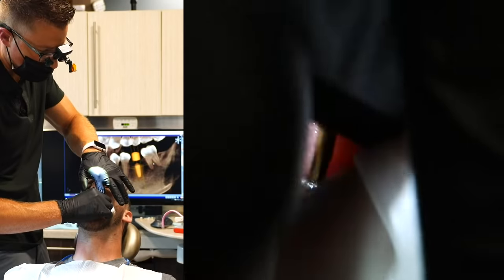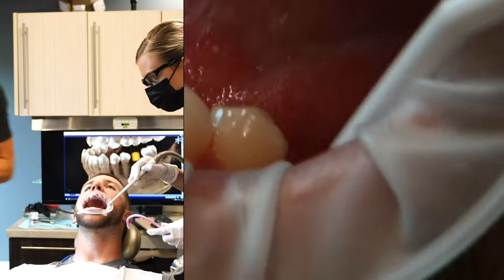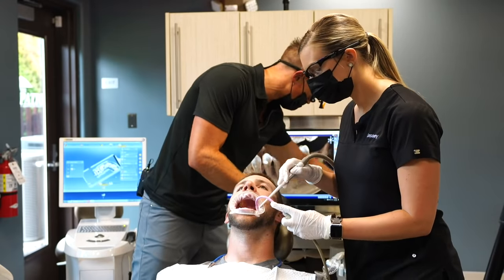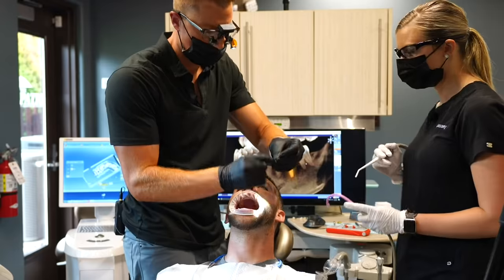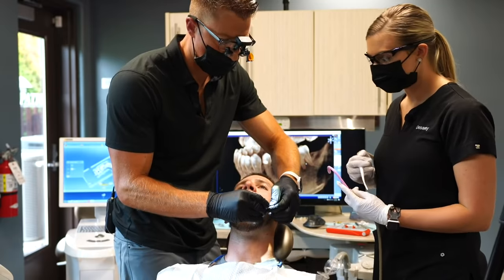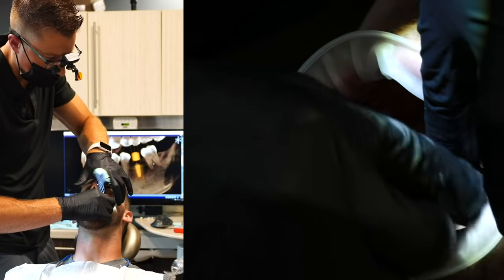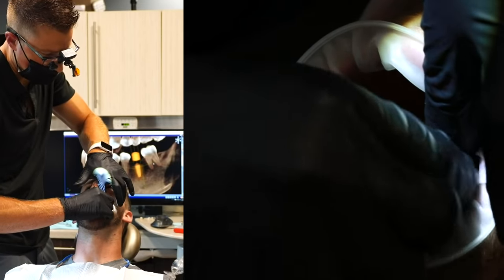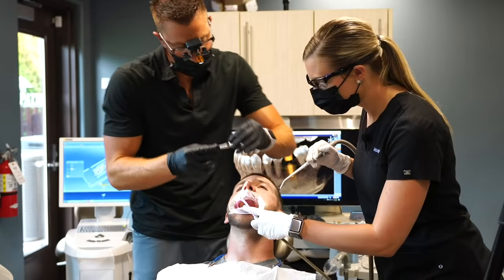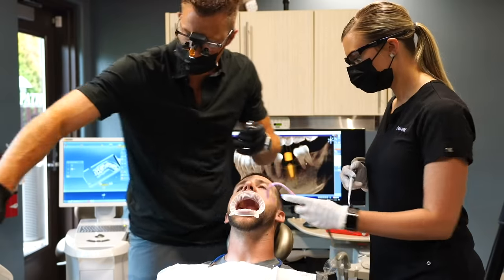And then the last little bit here is just putting a little healing cap. Let me show, I don't know if you're probably still zoomed in on the mouth there, Michael. I'll show viewers what a healing cap looks like. So that right there is our healing cap. And it is purple, color-coded with that same connection. And it will go right on top of that implant. And we'll tighten that down. There you go. Let's go ahead and rinse.